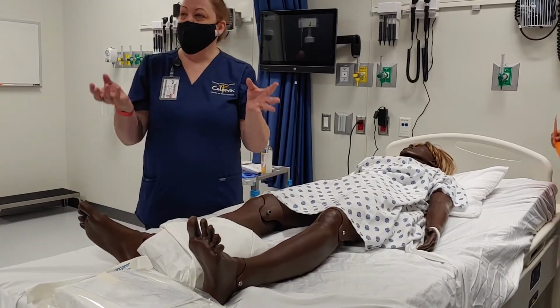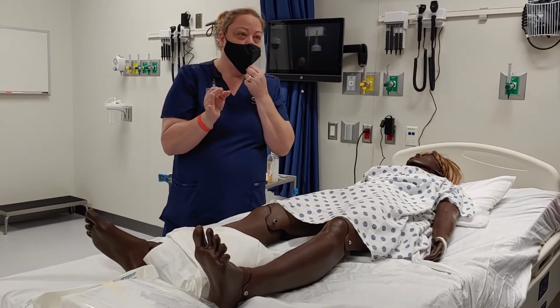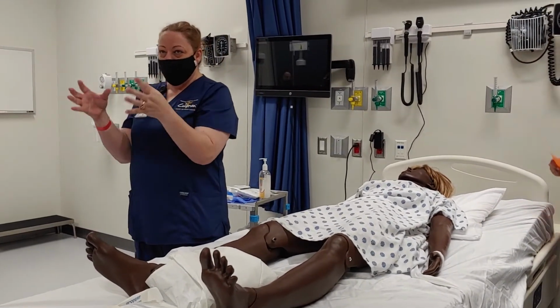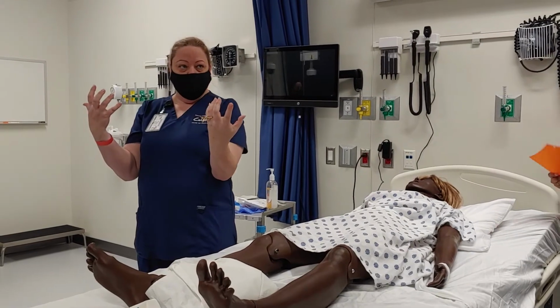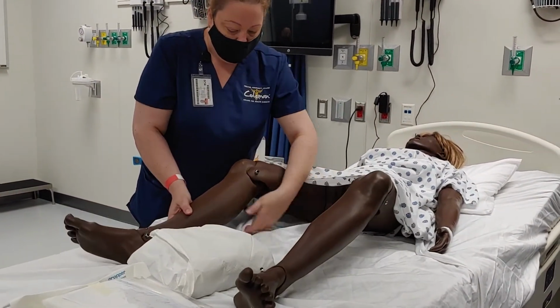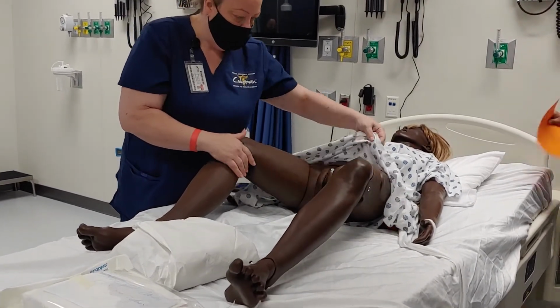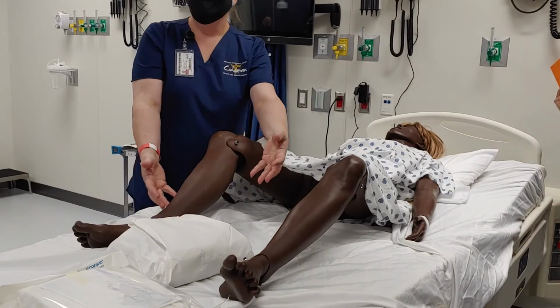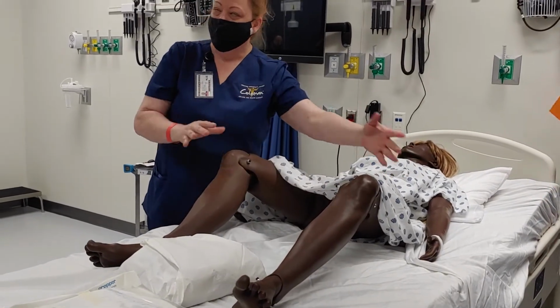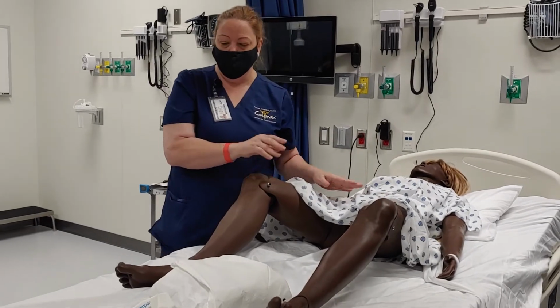I would tell them for the female, they're pretty much going to sit like frog-legged. So they're going to bend their legs up and they're going to let their knees fall to the side. Now, I'm not so sure this person is able to do that, but nope. Okay, so just know knees bent up, legs bent up, knees fall to the side, and that'll give you a little bit more of a workspace.